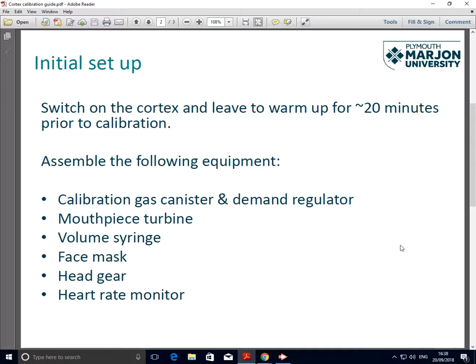In addition, we need to make sure we've got the following equipment to hand: calibration gas canister and demand regulator, mouthpiece turbine, volume syringe, face mask and headgear, and a heart rate monitor. To help you locate these items, I've included the following picture.